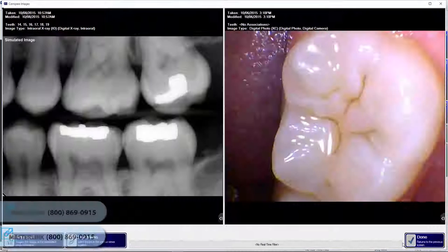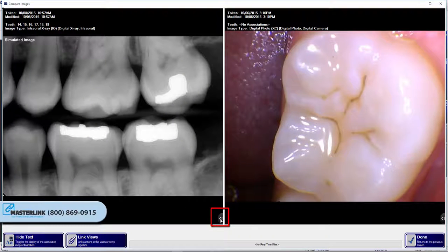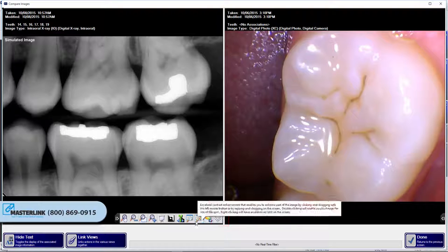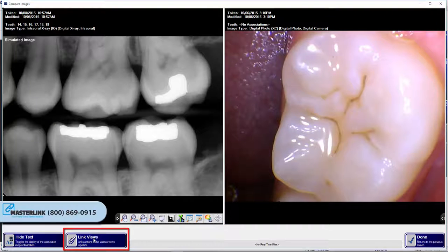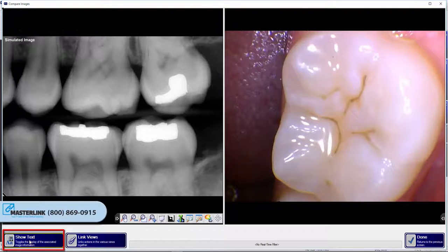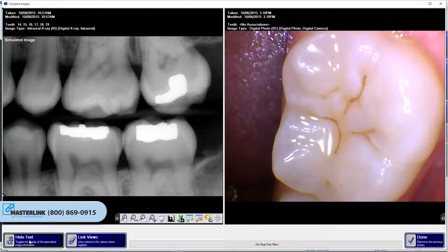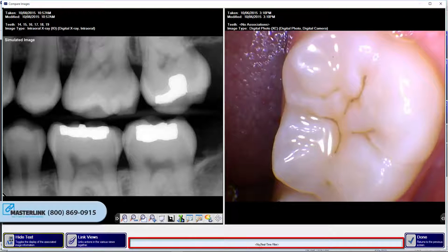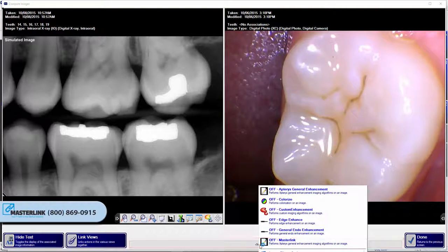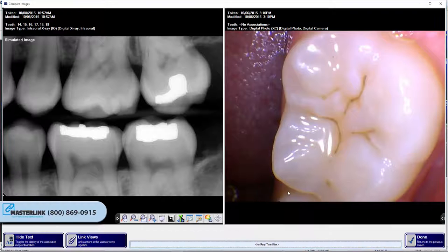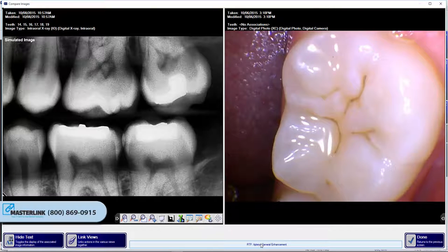To use the image manipulation tools, click on the arrow button to expand the functions bar. Click the Link Views button if you wish to make your enhancement apply to all images being compared — the button will turn green if the images are linked. Click the button again to unlink the images. Select the Hide Text button to toggle text display above each image. To enable or disable a real-time filter, click on the indicator bar at the bottom of the window and select the desired filter. The indicator bar text will change when a filter is enabled.